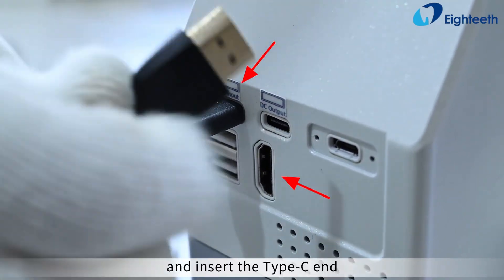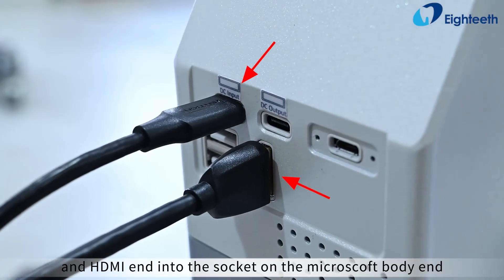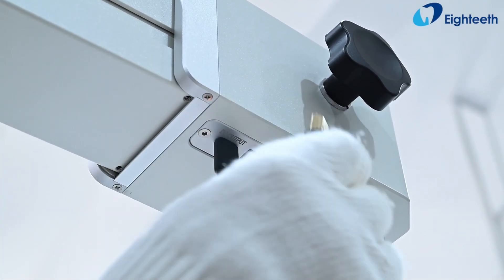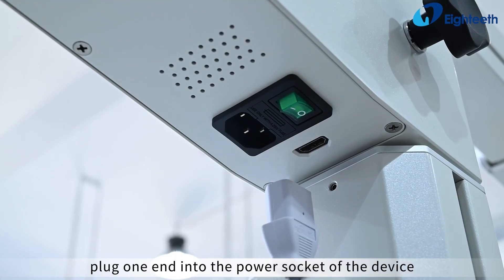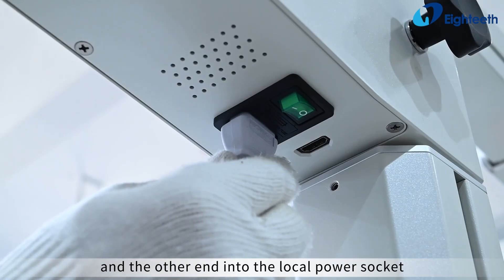Take out the data bus component and insert the Type-C end and HDMI end into the socket on the microscope body end, and the other end into the connection port on the lift arm. Take out the power cord, plug one end into the power socket of the device, and the other end into the local power socket.